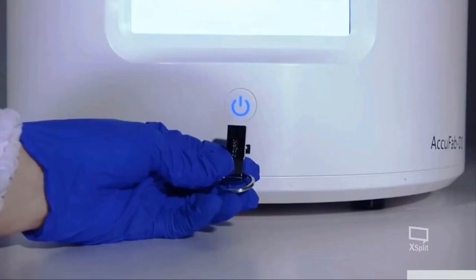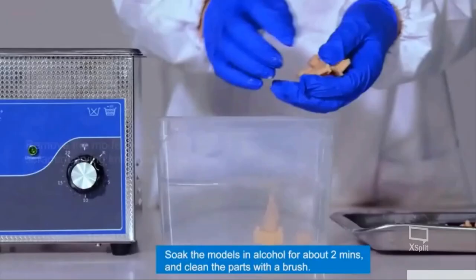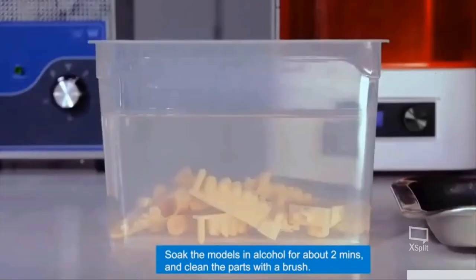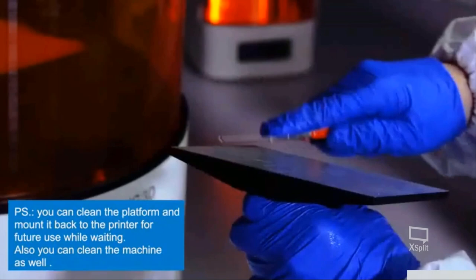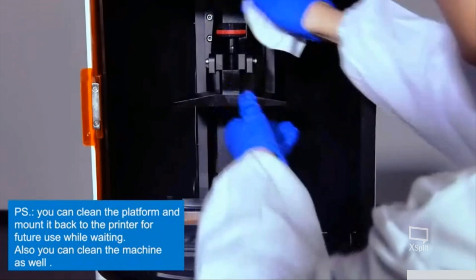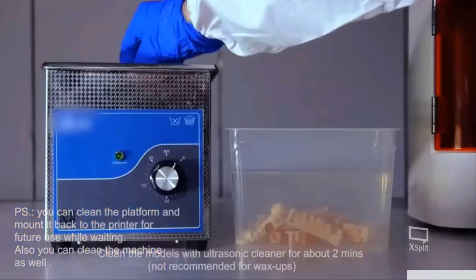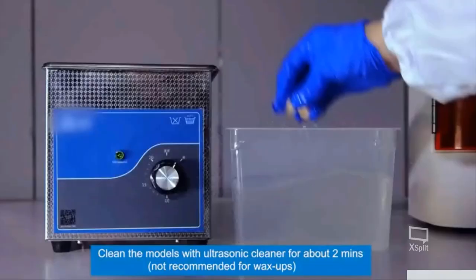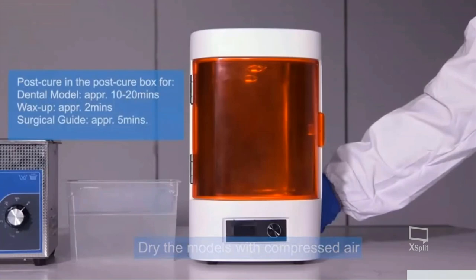Okay, once all these operations are complete, we can insert the USB stick and we are ready to print. Once the printing phase is completed, we need to put the model in the isopropyl alcohol. With the same alcohol, we can clean the printing platform, as you are seeing. We can, of course, also clean the printer. And then we are ready to put the models inside the ultrasonic cleaner. Two minutes are okay in order to remove the resin.